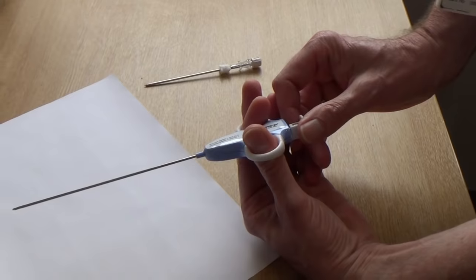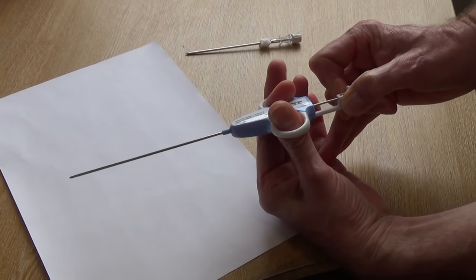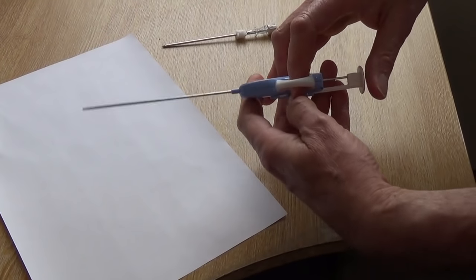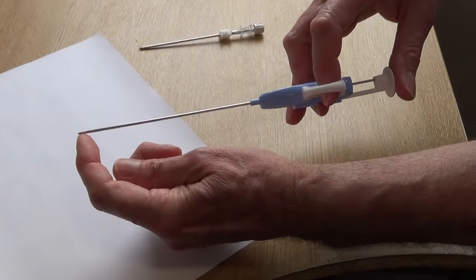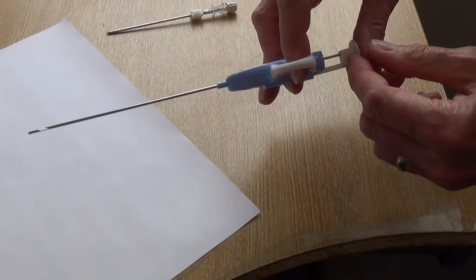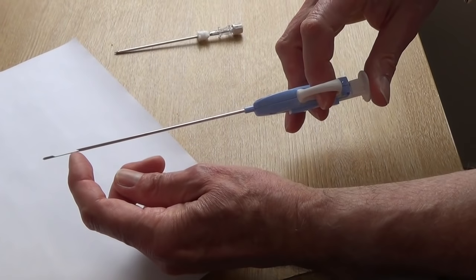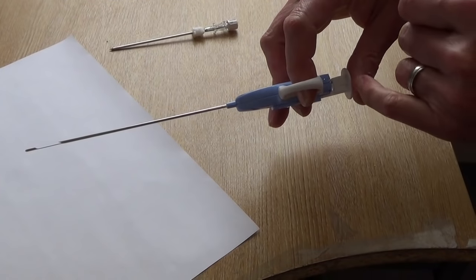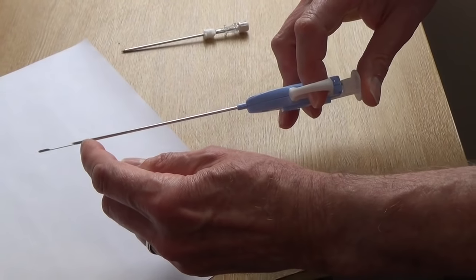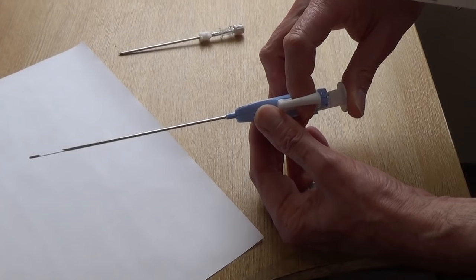The Temno biopsy needle is loaded by pulling back on the trigger. There are two positions depending on what size of biopsy you wish to take. When you insert the needle into the tissue you want the tip of the needle to be right up against the tissue that you wish to biopsy, and then advance by pushing on the trigger the center portion of the needle into the tissue, which will prolapse into that groove. The very last few millimeters of movement on the trigger will then close the outer portion of the needle and shave off the tissue that's prolapsed into the groove.